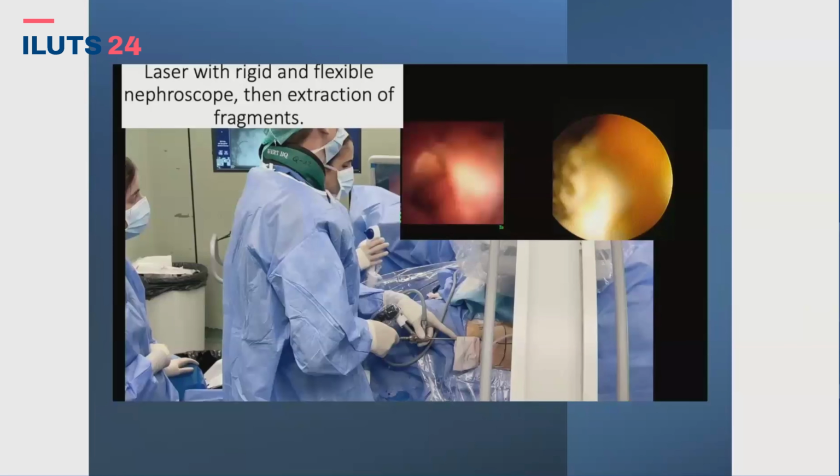So there's a small tip regarding what Marcos is saying: if you don't have a small nephroscope like the MIP system 12 Fr, you can use your semi-rigid ureteroscope to do that, because for sure all of you have a semi-rigid ureteroscope. Then you can do an Amplatz dilator to 12 or 14 Fr and just check with your ureteroscope that you are in. Of course, it's a long scope and you will be far away from the perc, but it's just to see that you are in the correct way, and then you redo your dilation.